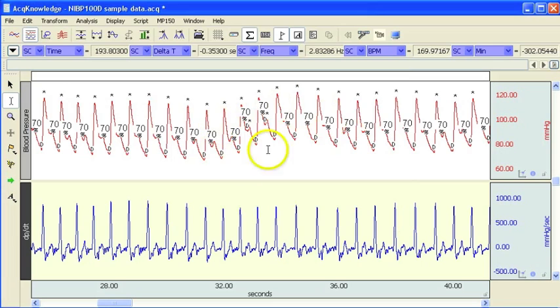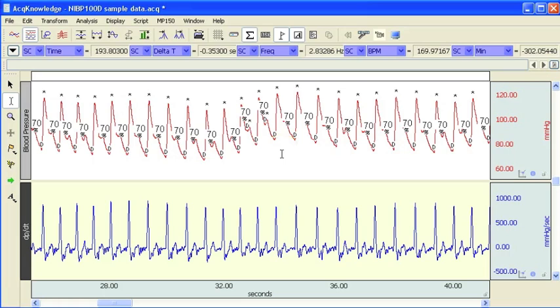So that concludes this demonstration of the acknowledge automated blood pressure analysis routine.